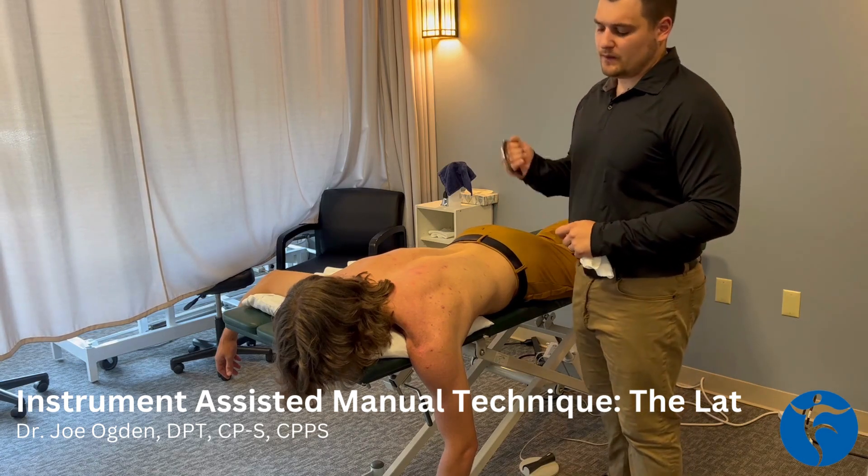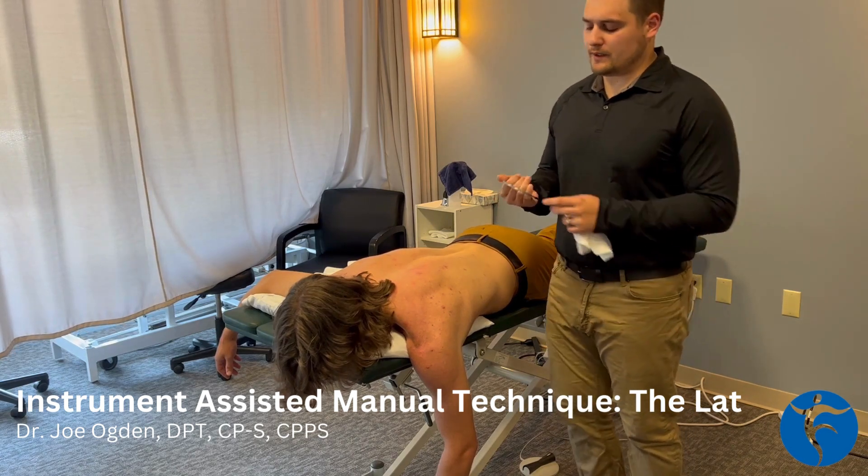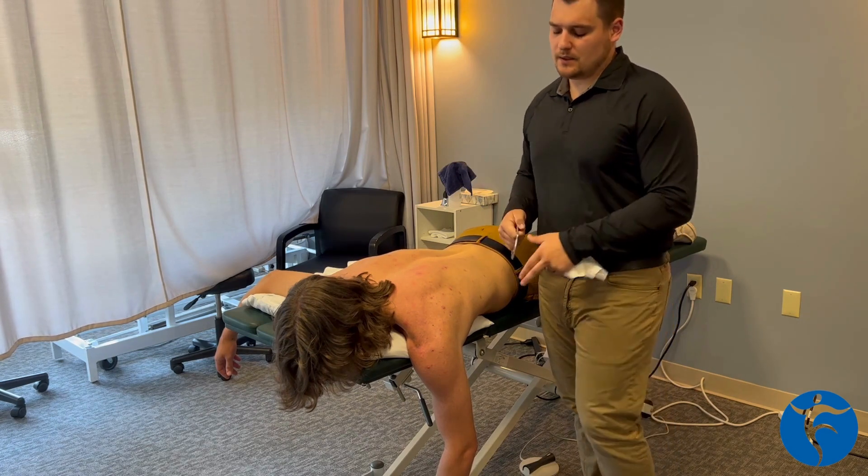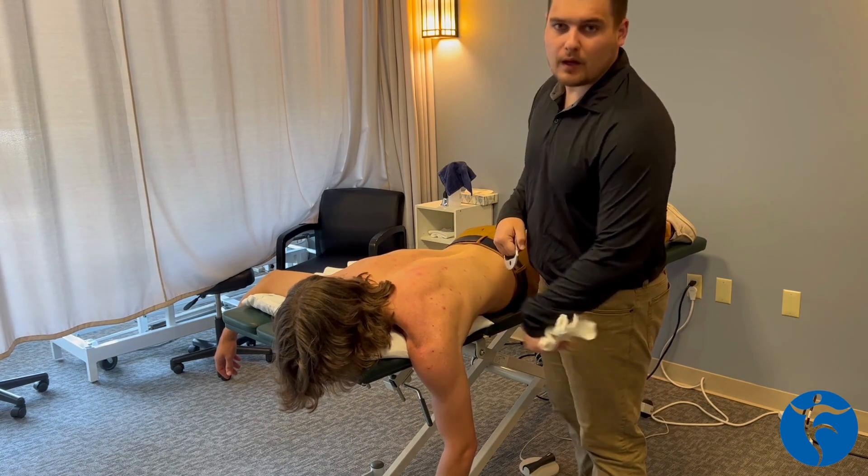Hello everybody, I'm Dr. Joe. Today I'm going to be going through instrument-assisted Graston technique on a lat.